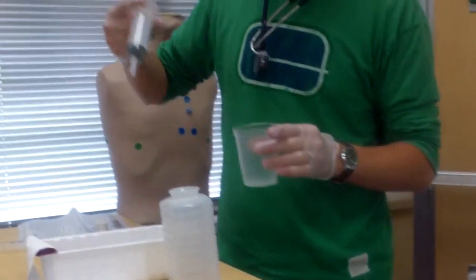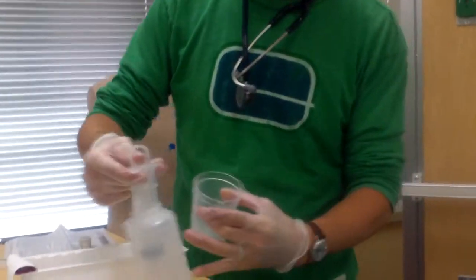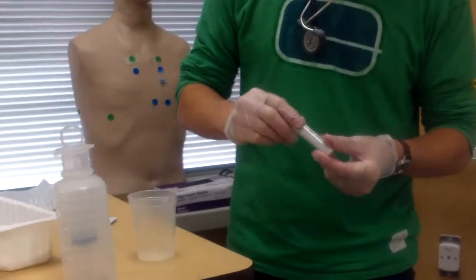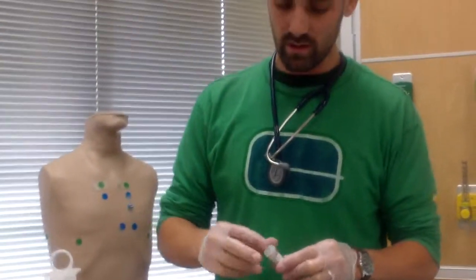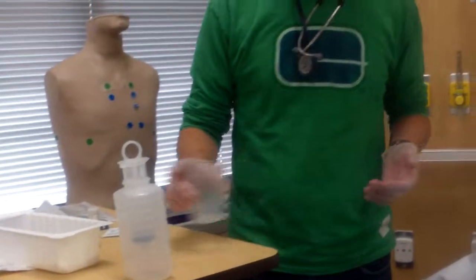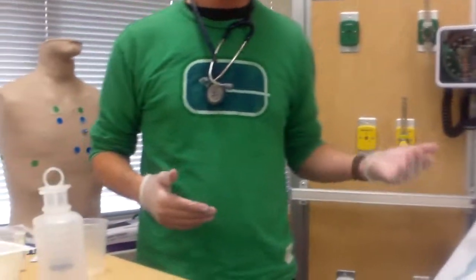Need to check the acidity, so I'm going to put it in this cup, squirt it in there. I'm also noticing that it is a light brown and green color, and I would also have one of these little test strips. Now these test strips, they only check for acid. I would have the ones that would actually tell me the exact pH level. I know that they're not taking any kind of antacids, so it should be a very low pH acidity. So that all checks out, and everything is good. The tube placement is now indeed in the stomach.